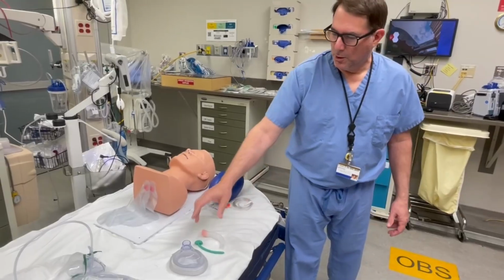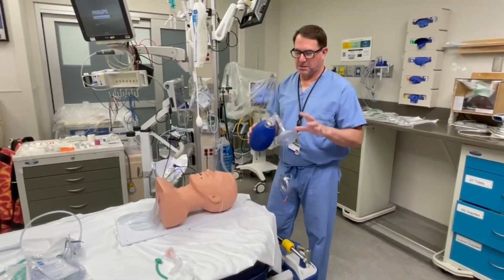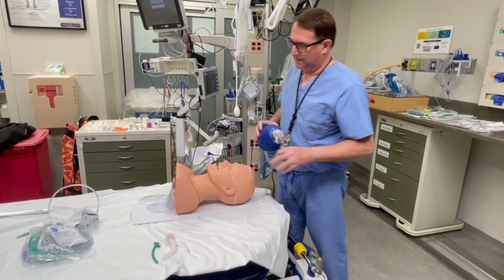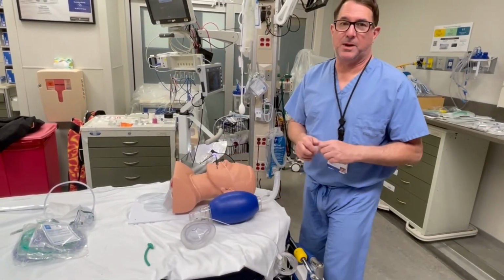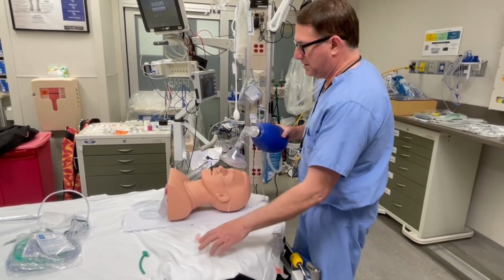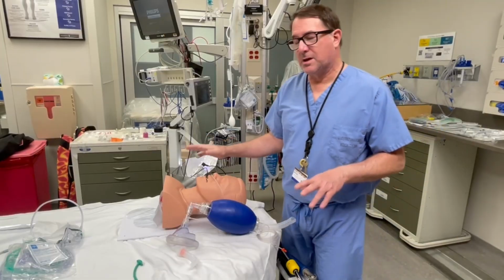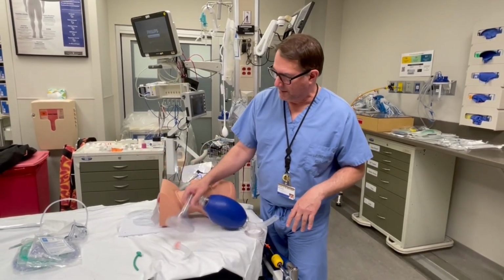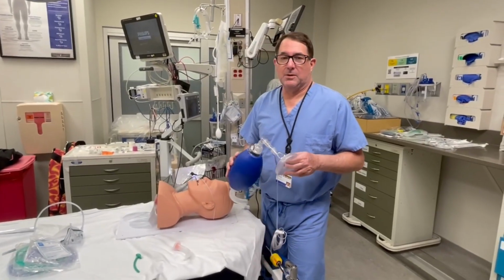All right, so what I'll see a lot of times is the blade will come out of the mouth, and here comes the therapist with their setup, and then they're doing this, and there's no adjuncts. Here's the problem: we've given this patient a paralytic, everything's relaxed, and the number one airway obstruction is the tongue. When we overpressurize the airway, all you're doing is driving their tongue down in their airway. I see video on a regular basis of people bagged without adjuncts. You're not getting rise and fall of their chest, your end-tidal CO2 will be like 10, 8, 9, and we're not doing it effectively.